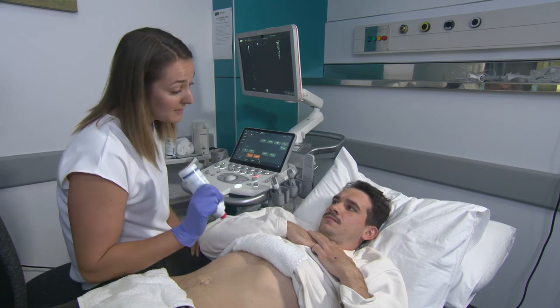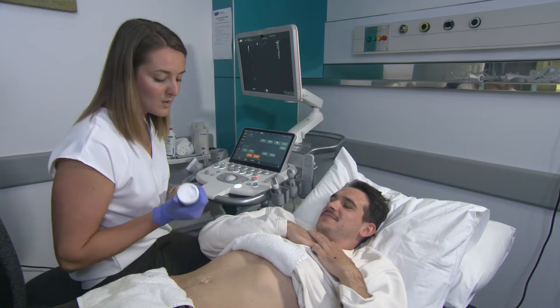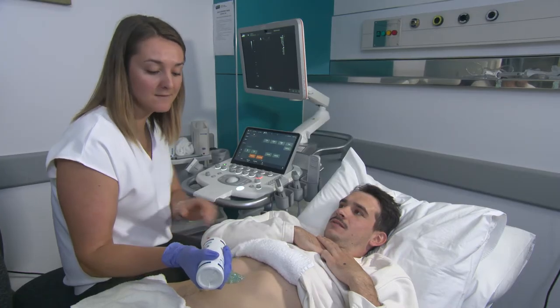What I'm going to do is apply some warm gel onto your tummy. If at any point you are really uncomfortable, just let me know. When we apply the gel, we don't want to have the tip of the gel bottle touching the patient so that we can reduce any infection control risk.